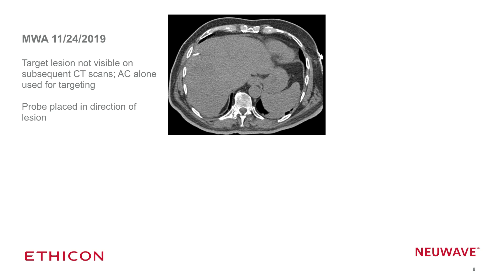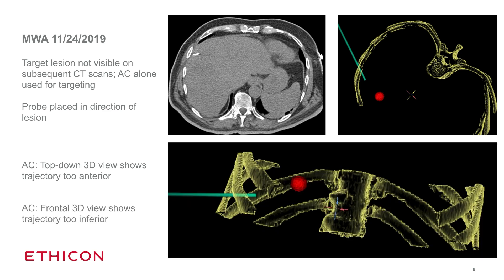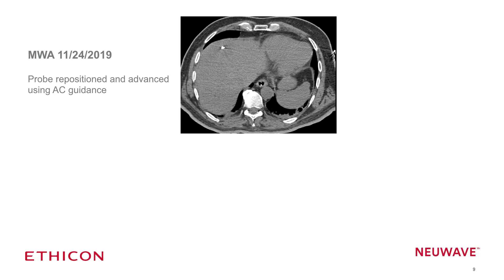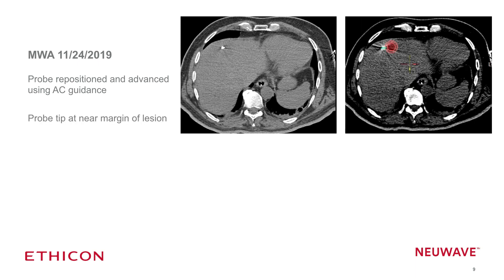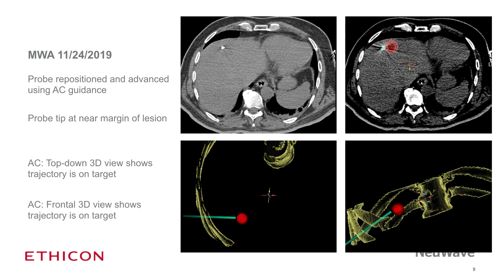I usually start by using ultrasound to get my probe into the liver in the correct general direction — even though I can't see my target, I get it pointed toward where I need to go. Then I use the ablation confirmation software. The three-dimensional views are quite useful: the top-down 3D view showed my initial trajectory was too anterior, and the frontal view showed it was also a bit inferior. I make adjustments based on ACS targeting, reposition the probe, and advance it. The ACS software then shows the probe is at the near margin of the lesion, on target in both the top-down and frontal views.